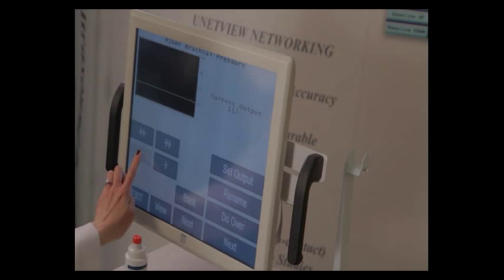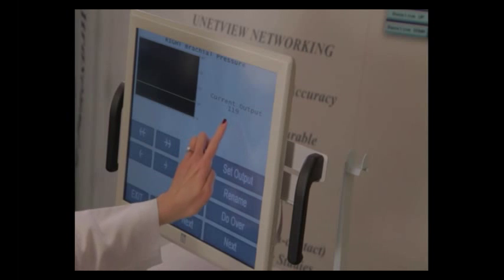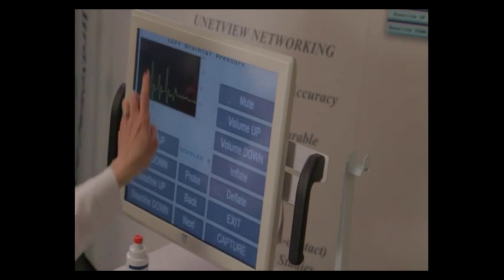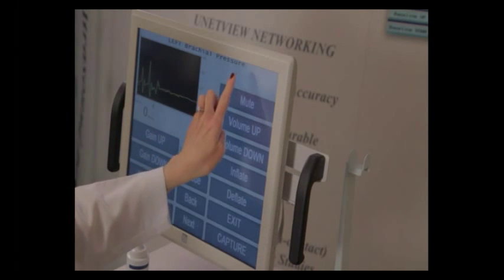You'll notice the pressure going up, and we'll see that first pulse occurred at 119 millimeters of mercury pressure. We're happy with that, so we're going to press next. The screen is now prompting us to take a pressure at the left brachial site.